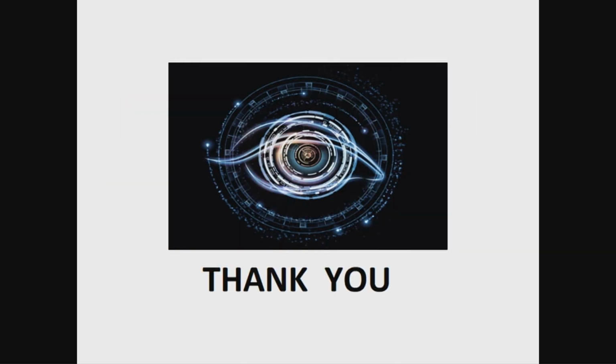Thank you, Dr. Marwat. Any comments? You saw a small video clip using the loop for ILM peel. How much does it cost, and is it reusable? It is reusable in our cases. Its cost is about 30,000. So that's not bad, but it's very useful.